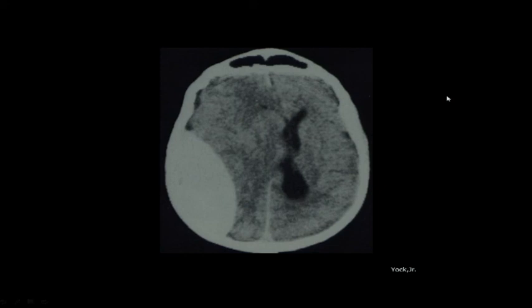Can I ask you a question real quick, sir, on the ultrasound stuff? The streaking of periventricular whiteness. Initially, you can call it the flare phenomenon and repeat the ultrasound in like a week, to see if it's periventricular leukomalacia, because periventricular leukomalacia starts off echogenic. It can stay echogenic, and that's grade 1. Then it can start getting mixed echogenic and lucent actual holes, and that's like grade 2.